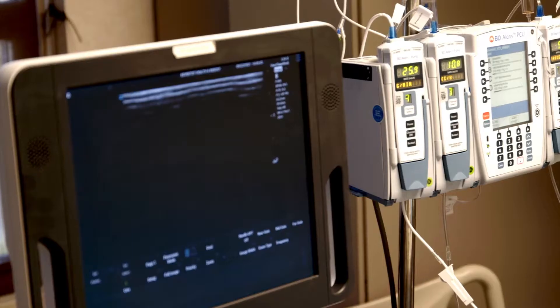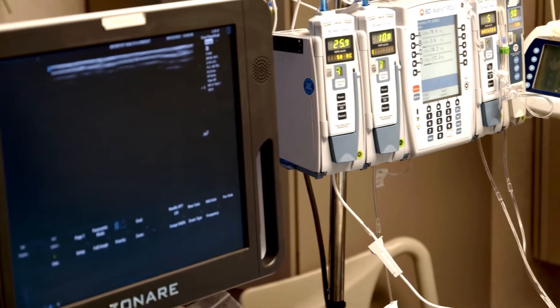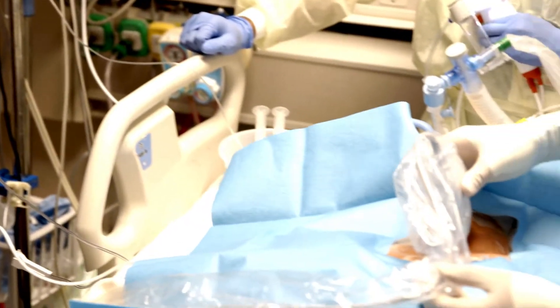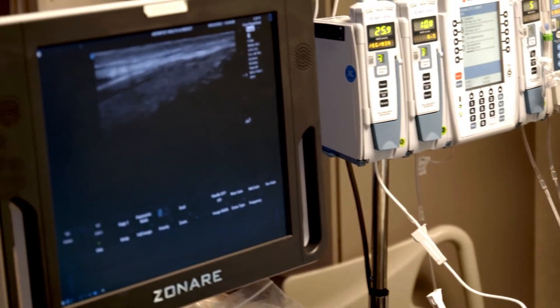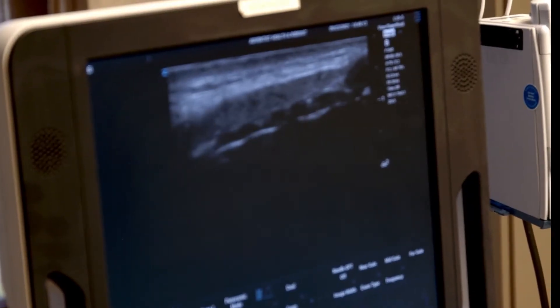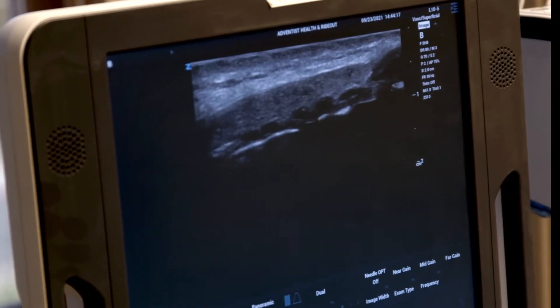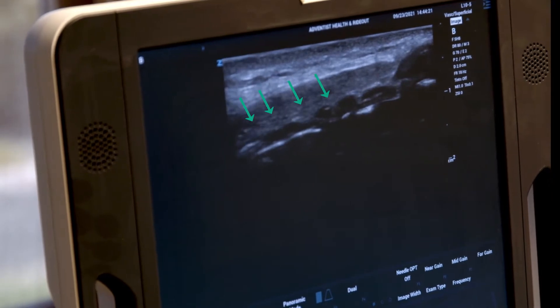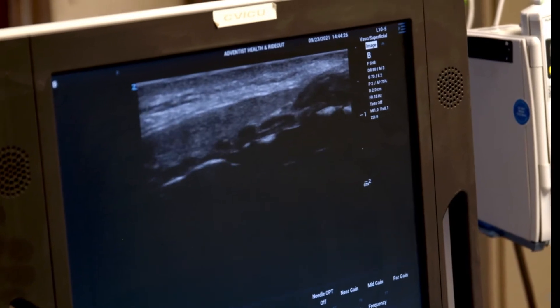Then I'm going to turn the probe longitudinally, which I think is really helpful for locating the spot where you're going to place the tracheostomy. Going vertical now — you can start to see his tracheal rings. They look almost like beads on a string — black dots or ovals. Those are his tracheal rings. If you look a little cephalad to that, you'll see a larger oval black structure — that's his cricoid.